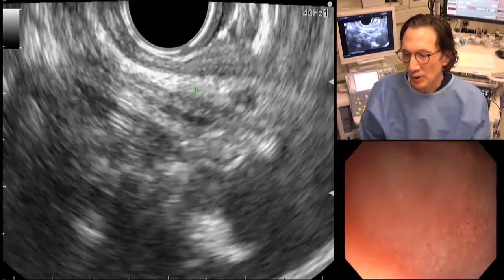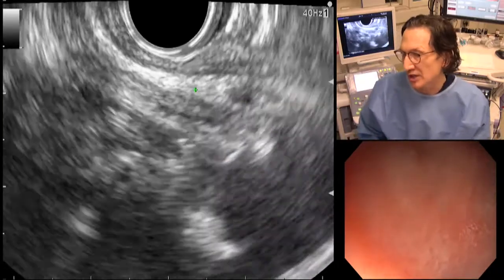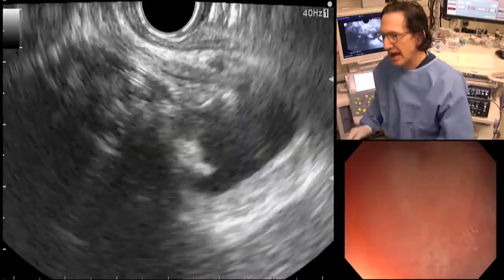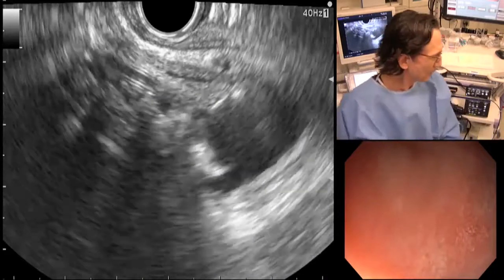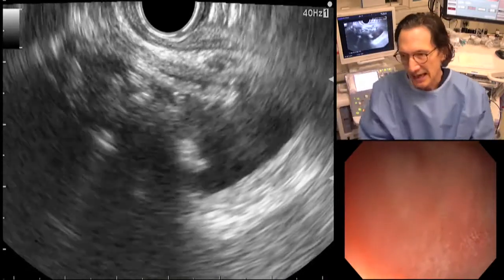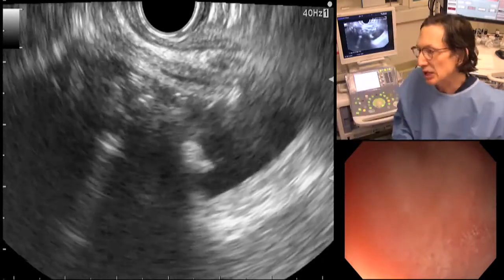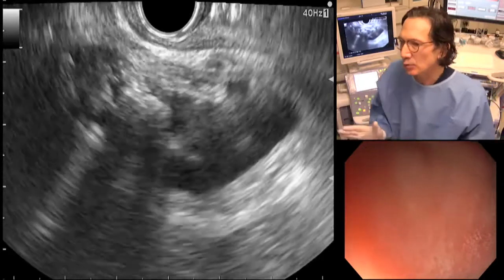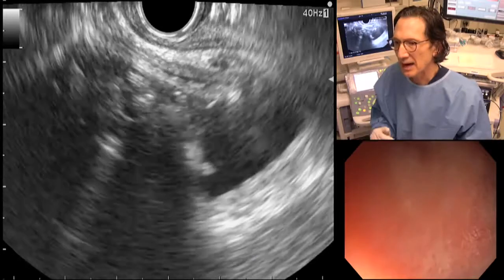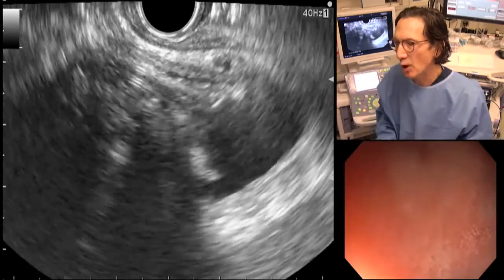Number two, we have the ability to infuse water into the gallbladder to distend it some more. And why don't we just do that to show that effect? So I'm going to have Kate or Jeannie come over, or Julie. And we're going to disconnect the drain, and we're going to inject some water through our cholecystostomy tube. That is an additional way. If for any reason we're not sure that this is the gallbladder, we could inject some fluid and see that fluid fill the gallbladder.